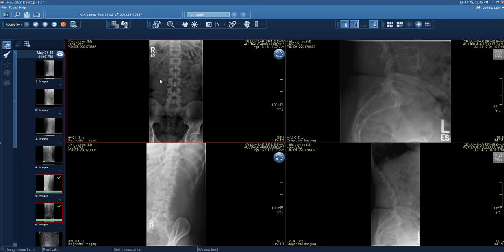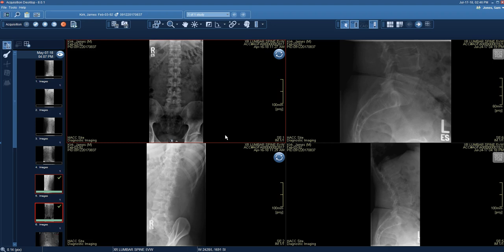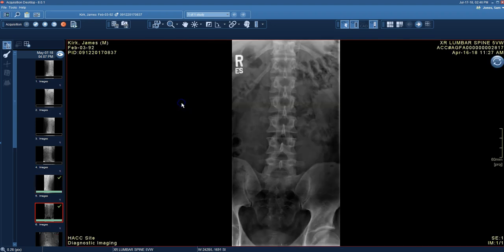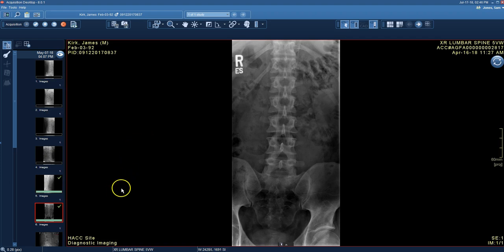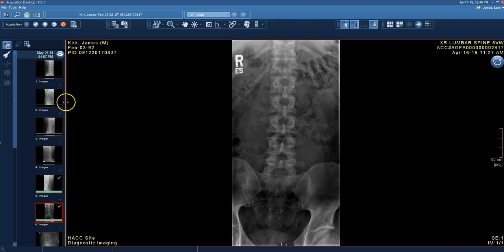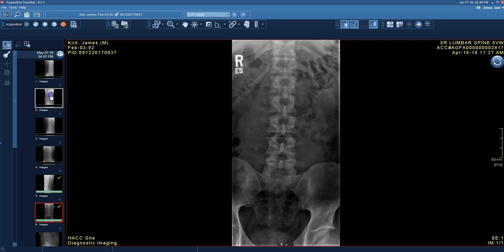I'll highlight the row that has his lumbar spine, click on Images, and that launches me into the images of his lumbar spine. This is in a four-up layout — viewport one, two, three, four. I want to look at the images bigger, so I'll double-click on one and that gives me a one-up viewport. This is the thumbnail or series navigator window — anything I've looked at has a full green bar and a check mark, and things without it I haven't viewed yet.